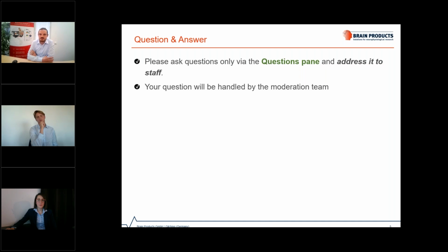But as I said also in the talk, it's rather easy to convert scores from a different software. Once you can export this to a list of scores, for example, it's rather easy to convert this to BrainVision markers as well, and then you can continue with the sleep scoring solution on those markers. This could work in a semi-automatic process where you had a pre-scoring from a different software and then inspect the scores and validate them with the sleep scoring solution in Analyzer.